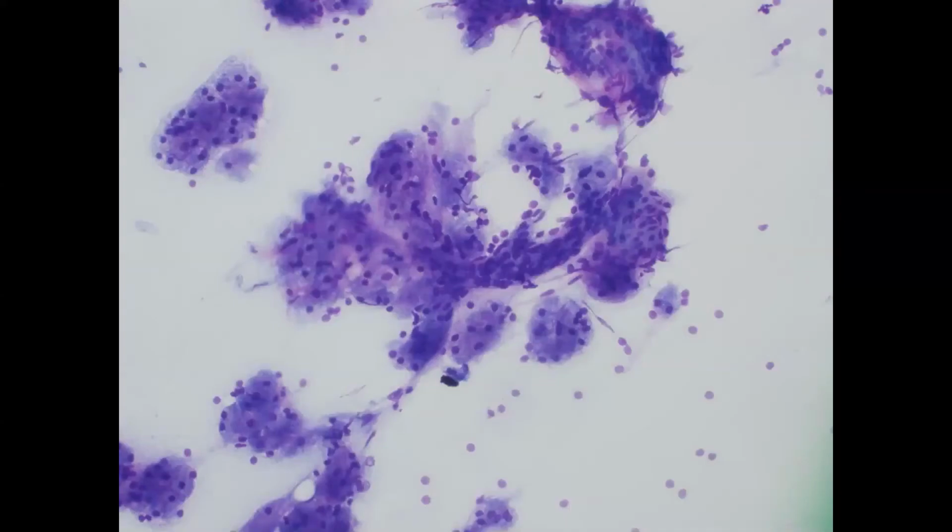You can see at higher power, again, this is a serous gland, so the acinar cells will actually have a large quantity of this very azurophilic granular cytoplasm, so very coarsely granular blue azurophilic cytoplasm. The nuclei are somewhat eccentric. You can see that the cell membranes are very inconspicuous, so this has a very syncytial growth pattern within these acini, you can say.